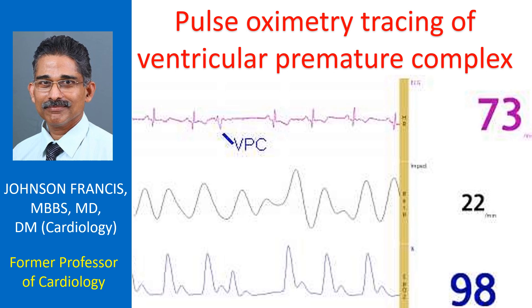The middle tracing shows the variation in thoracic impedance with a respiratory rate of 22 per minute. Lower tracing is the pulse oximetry tracing and the oxygen saturation is displayed as 98% in dark blue.